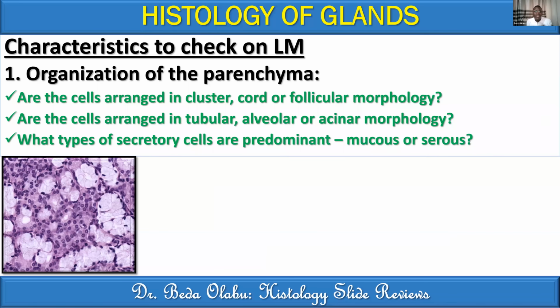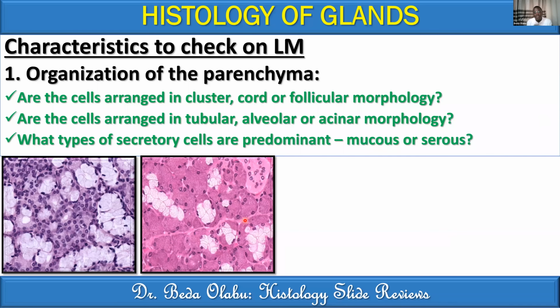Okay, the second image. I want you to try that again. I've enabled the chart for you. Classify that one. Okay, great.